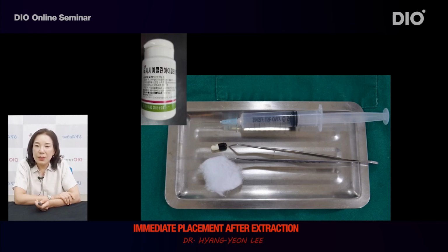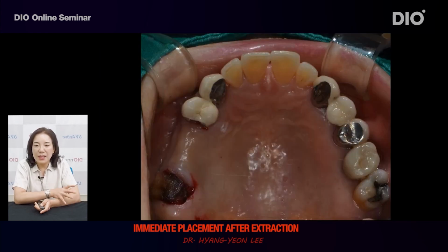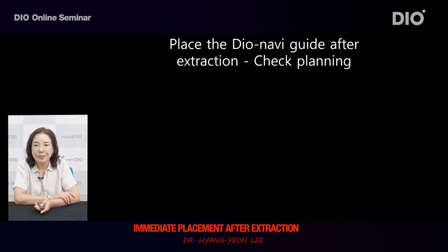The doxycycline on the cotton ball is the doxycycline that we eat. Loosen the capsule and put doxycycline on the cotton ball that has saline on it and insert it into the tooth extraction socket until the time of surgery. If the tooth extraction socket is large, use a large cotton ball, and if it is small, use a small cotton ball. If you use several small cotton balls, there is a possibility that some may remain in the socket. Therefore, it is important to use a single large cotton ball.